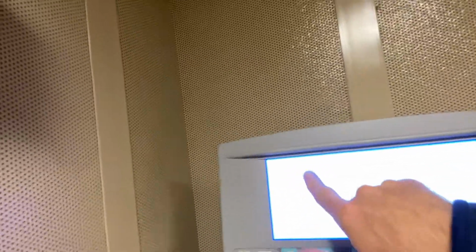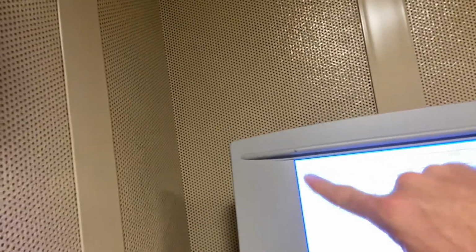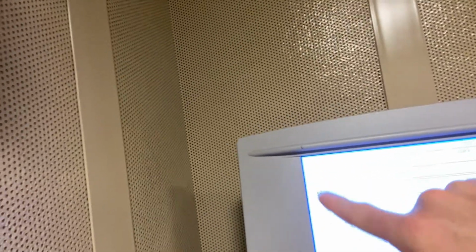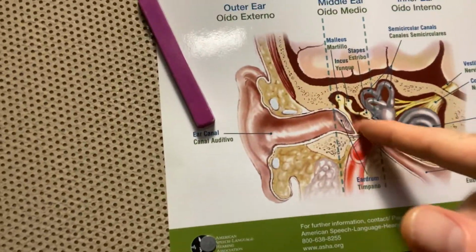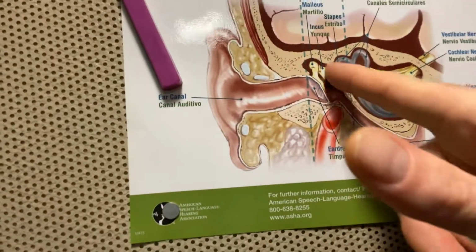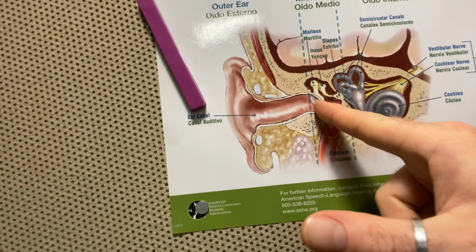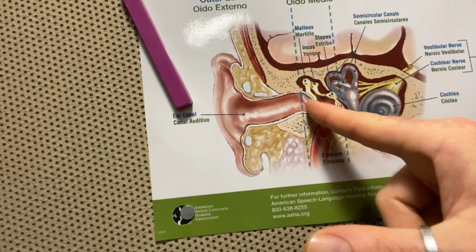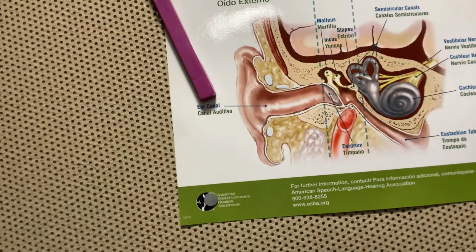If we have a tympanometric peak that looks like that, more or less centered around 1 and 1.5 in terms of milliliters on this axis and more or less at 0 on this axis, we have a normal tympanogram. What that means is that we know there is no fluid or gunk in the middle ear space. Think about it. If we put 200 decapascals of pressure into the ear canal and it doesn't move, that's because the space is filled up with fluid.